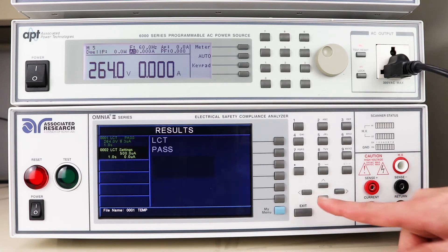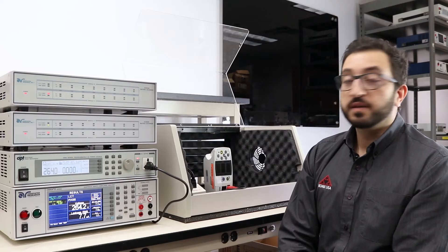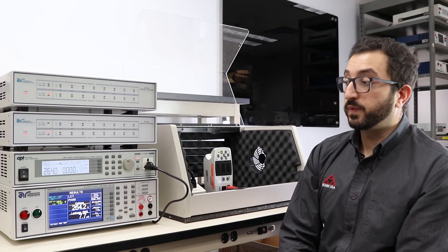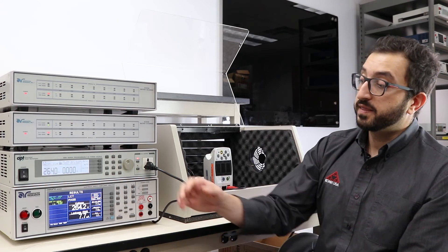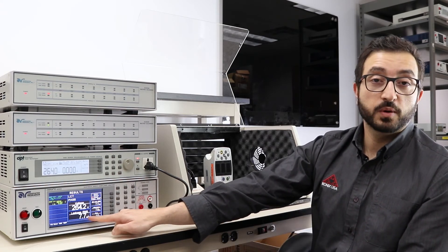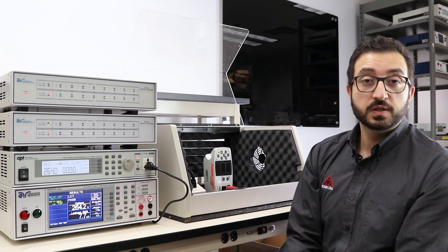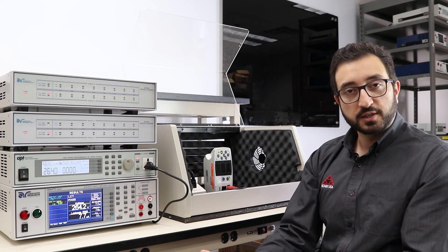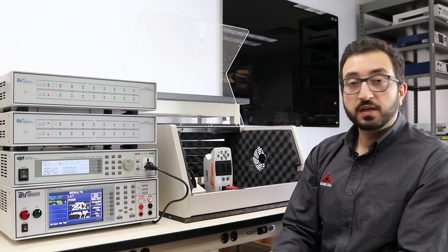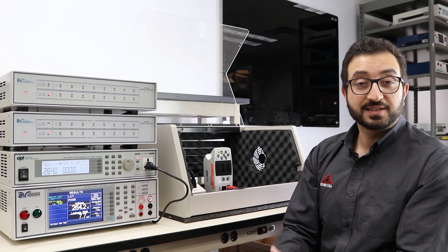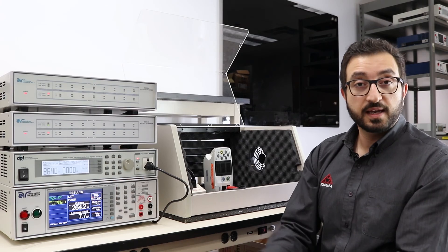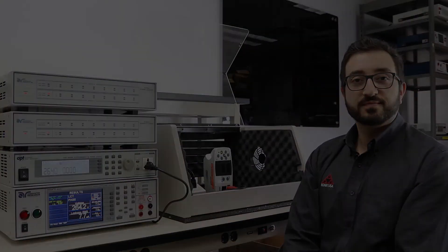The second step was simulating the reverse polarity condition of T2 and the 180-degree phase difference between T1 and T2. In that condition, we recorded about 7.7 microamps. The results did not change much, but this gives you an idea of what the mains and applied part leakage test looks like and how it is set up.